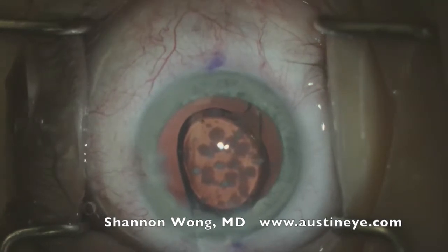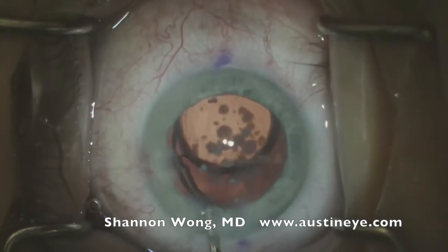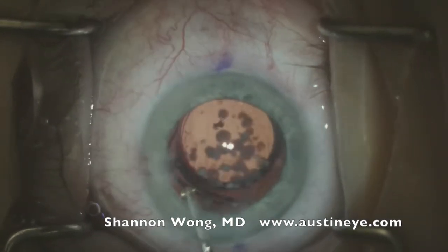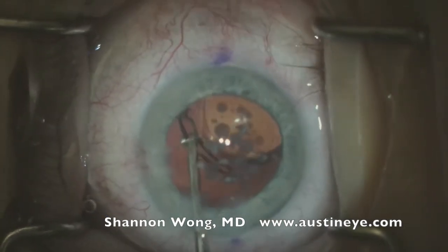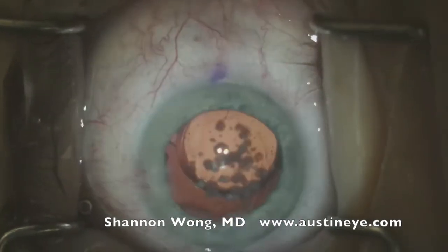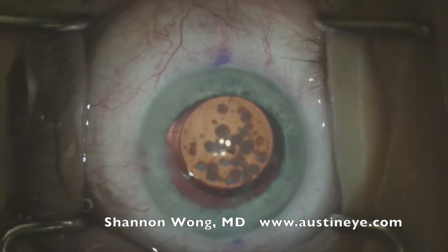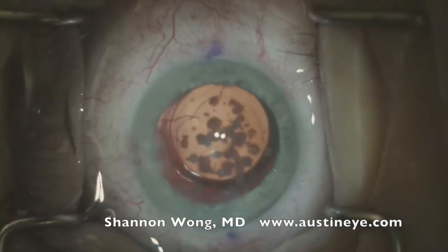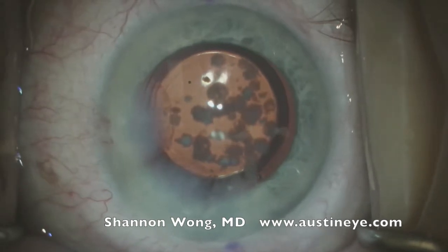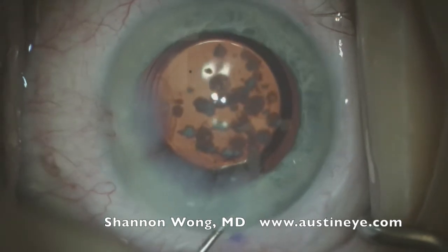We used the LensX laser to mark the cornea and create alignment marks for this lens, making it very easy to properly align this and any other toric lens in the eye. We line up the lens marks with the corneal marks created by the LensX laser. The marks are now at about 12:15 and 6:15 and they are aligned with the corneal marks.